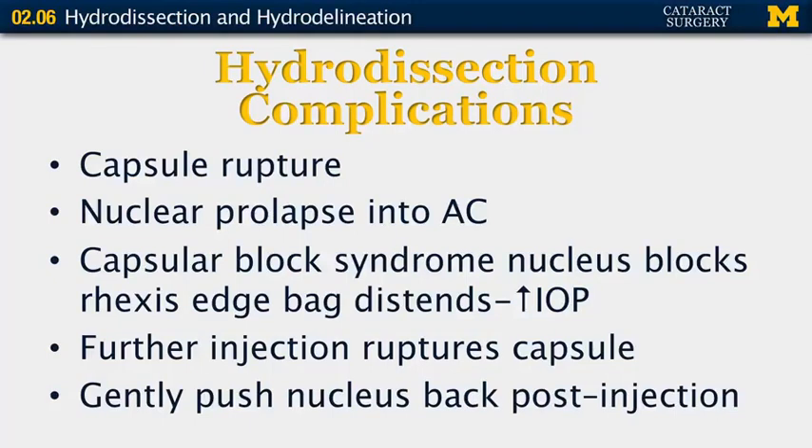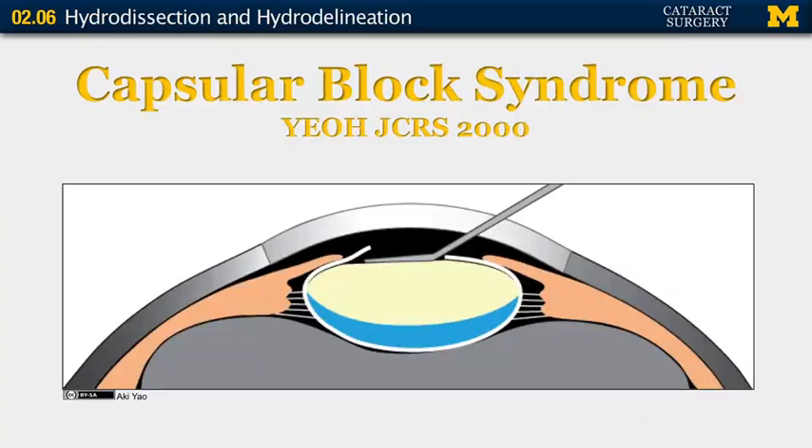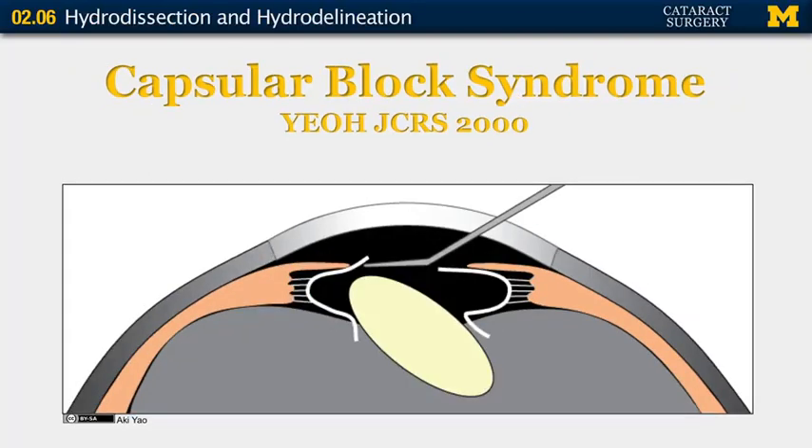Capsular block syndrome is an important, although fortunately rare complication, where the nucleus blocks the edge of the capsular rhexis, allowing the capsule to extend posteriorly and increasing the intraocular and intercapsular pressure. If injection is continued, the capsule can rupture posteriorly. This can be prevented by gently pushing on the nucleus after hydrodissection — pushing centrally to allow the fluid to come anteriorly. In this example, fluid behind the nucleus has pushed the nucleus against the edges of the capsular rhexis; if injection is continued, the capsule can rupture and the nucleus can go posteriorly.